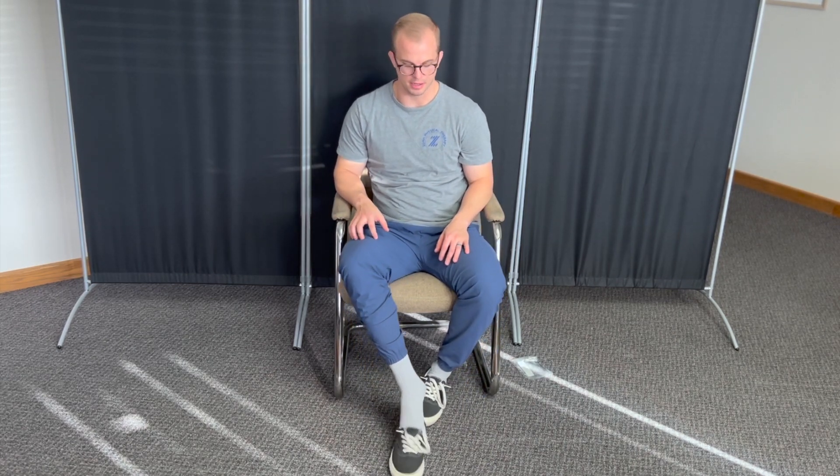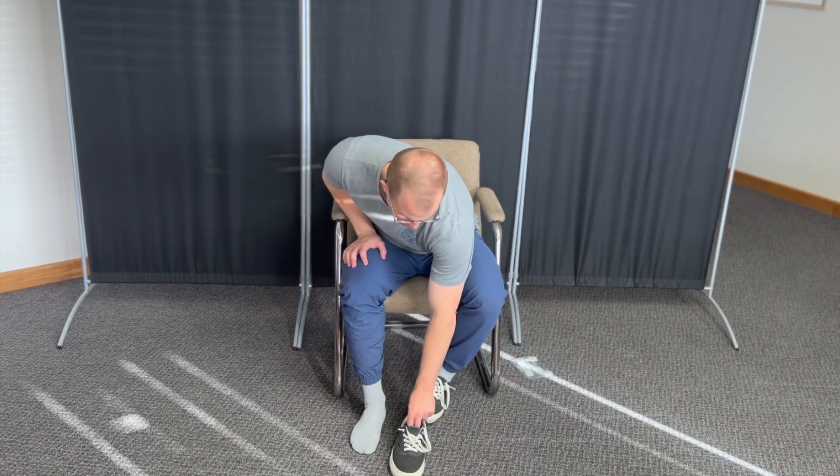As your pain starts to decrease, you might be prescribed to remove a layer of the heel lift. You'll start with the bottom layer — pull it away. Once the entire layer is off, take the remaining two layers and reinsert them into your shoe. You'll continue that progression until you have one layer, and then no more layers in your shoe.